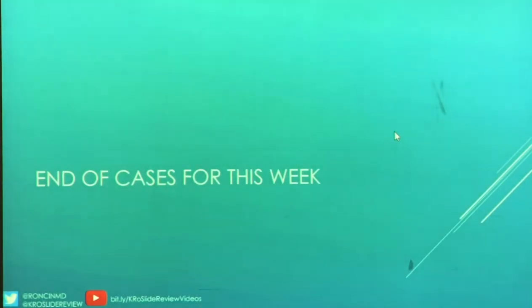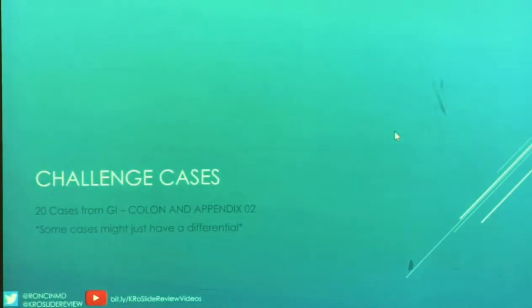Okay, and that's what we have for this week. So there are 20 challenge cases from this lecture. And some of them are things that we talked about, some of them are not, but I just thought some of them were really cool lesions for you guys to look at. Do keep in mind that some of these are extremely difficult, so do your best, but don't worry if you don't get everything on the first try, because I definitely don't get everything on the first try either.